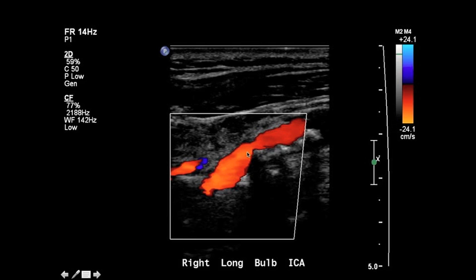You can see that if there's an area of increased velocity, as there is here after this stenosis, there's a higher velocity here than there was in the vessel coming in, because it's a brighter color here.